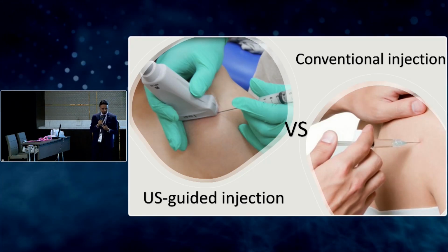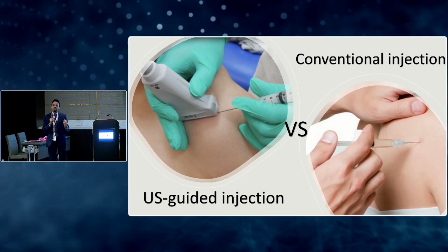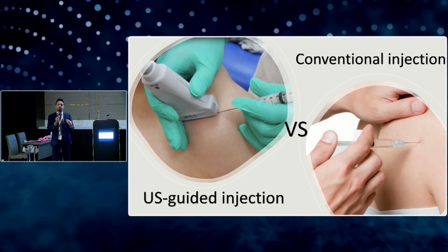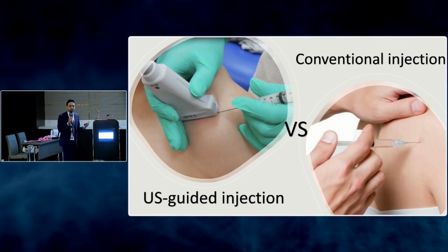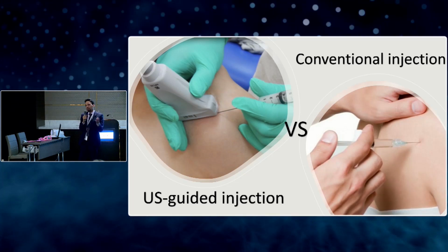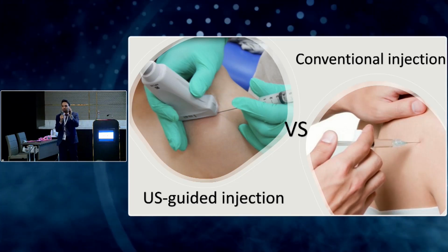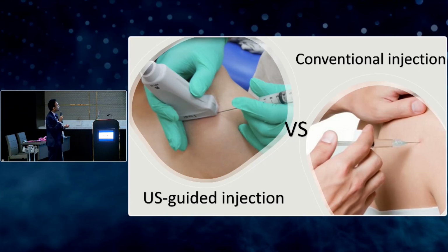That's perfect. Definitely. And some patients come to me after a previous injection, and when I scanned them, they had a huge swelling. I asked, did your doctor aspirate that? They said no, because the doctor doesn't know what's going on inside. So it's better to scan to see if there's any effusion, to aspirate that for analysis, or to inject.